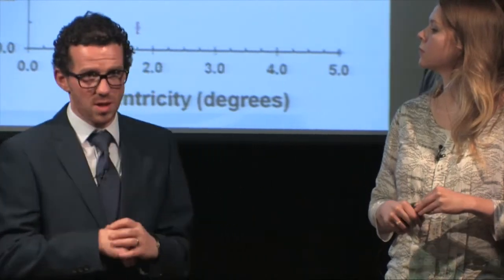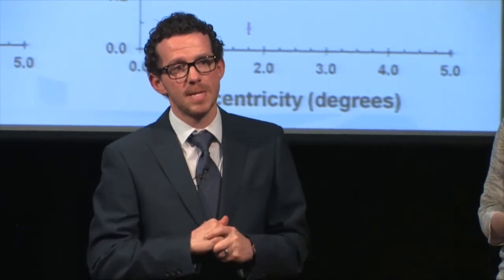There have been several hypotheses. You're leaning toward about 40% atypical? Well, I think about 40% of people have an atypical profile. I think Tos Berendschot's paper suggested it was nearly as high as 50% of people, which I haven't seen, and I know the lads haven't seen, when we use flicker.